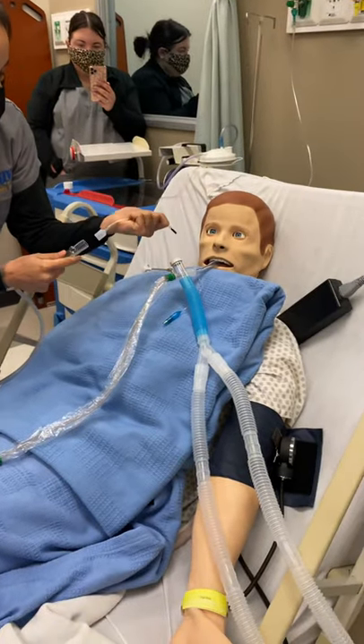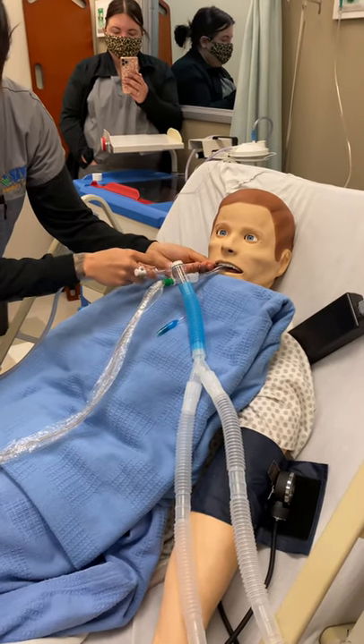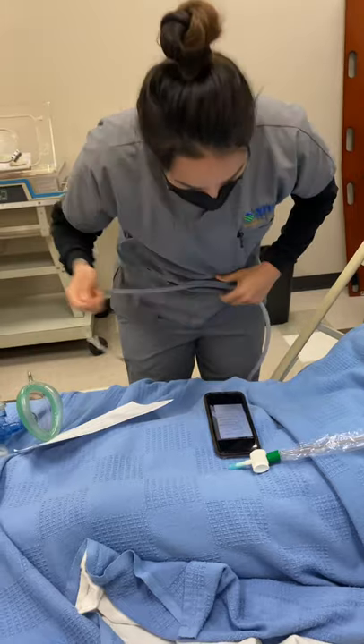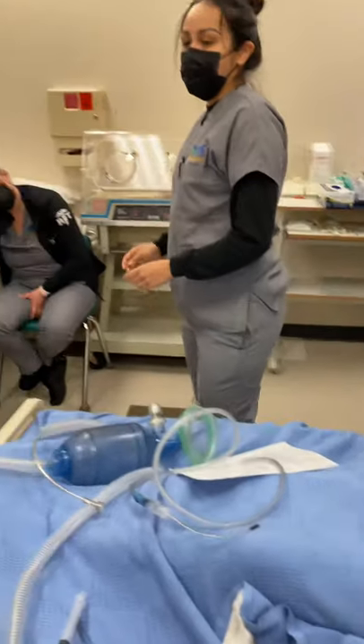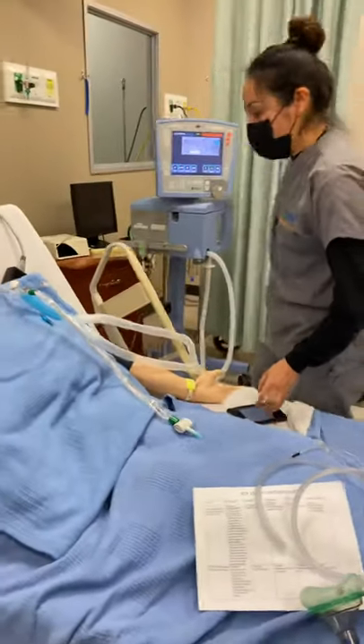I'm going to go ahead and put that in here. And then at this point, we're going to go ahead and deflate the cuff and give the breath at the same time — simultaneously — the manual breath.